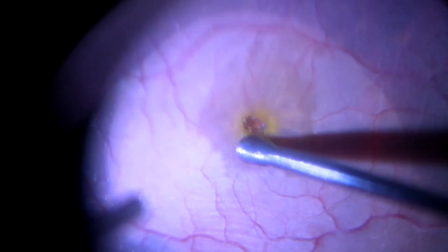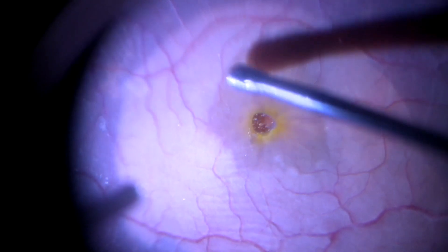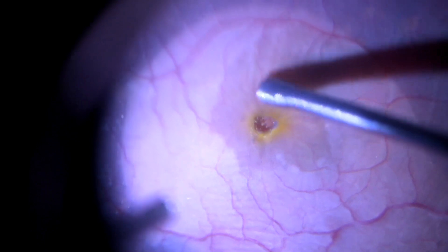Hence, the retinal massager is a safe, reusable, multi-purpose tool and can be used as an adjunct for various vitreoretinal procedures.